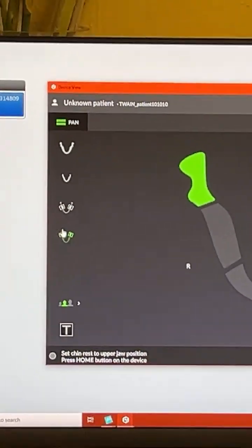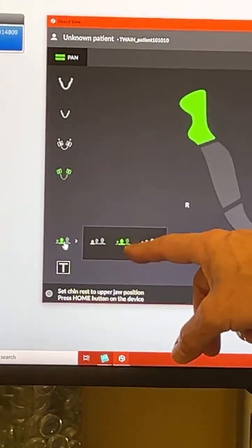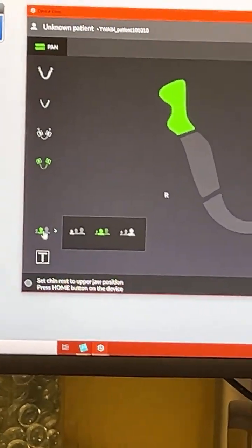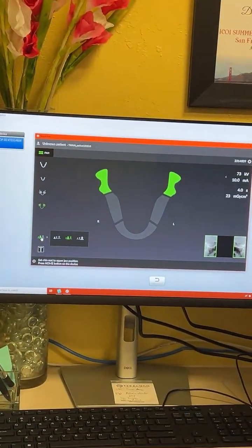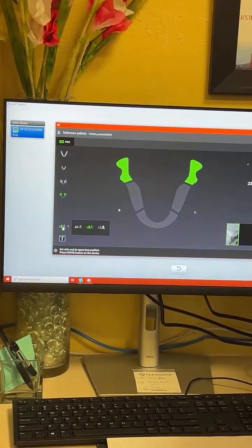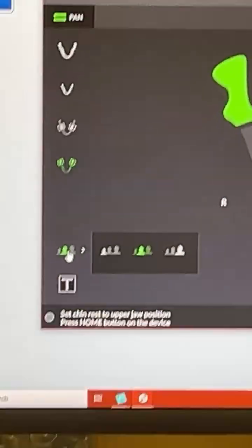Got it. And then you mentioned something on the bottom. This is the patient size. Small, average, and large. Okay. It really has to do with bone density. So you're trying to guesstimate the best you can somebody's bone density, which is obviously impossible. But you're trying to look at the mandible, their jaw, their neck, their wrist, their bone. See if they're really thick, short neck, stocky, broad shoulders, you're probably gonna go higher.